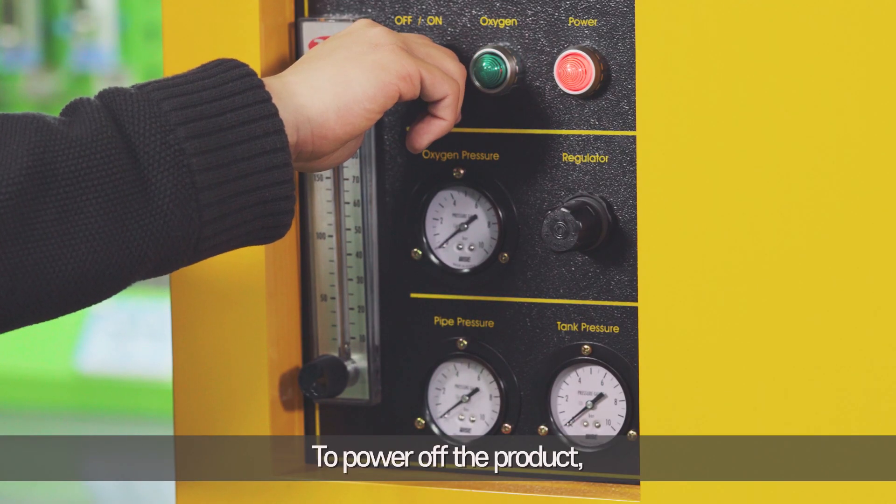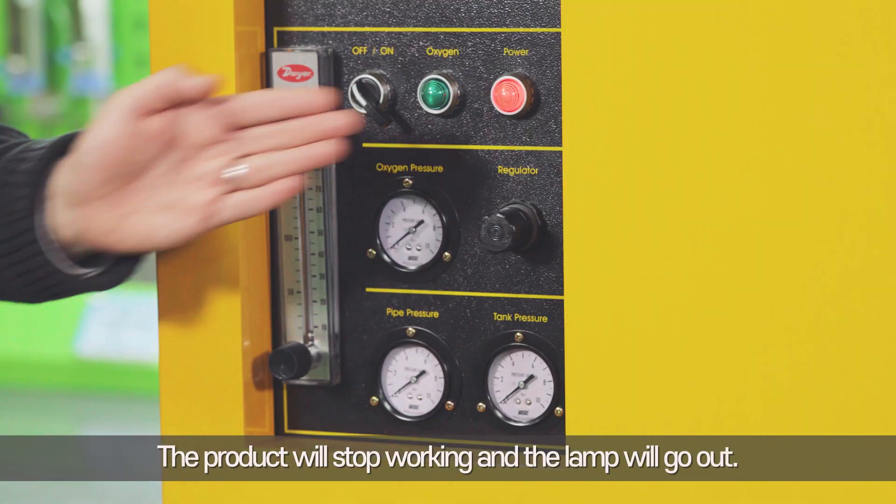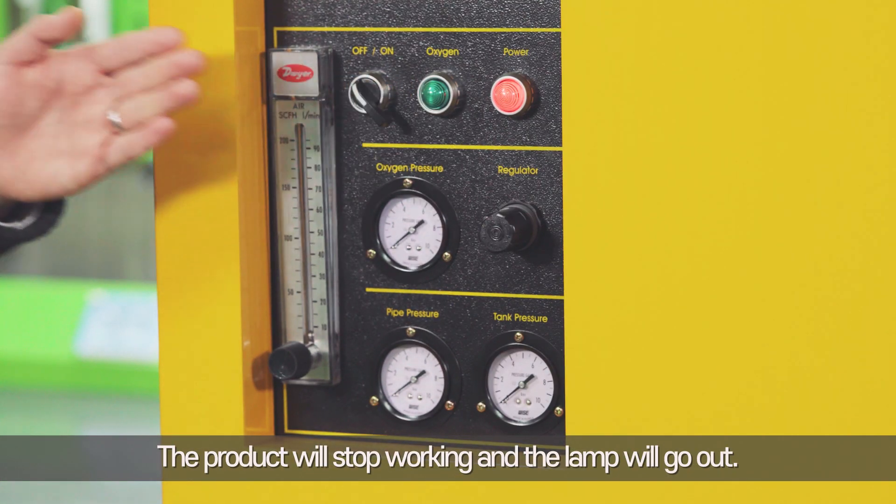To power off the product, turn off the operation switch on the control panel. The product will stop working and the lamp will go out.